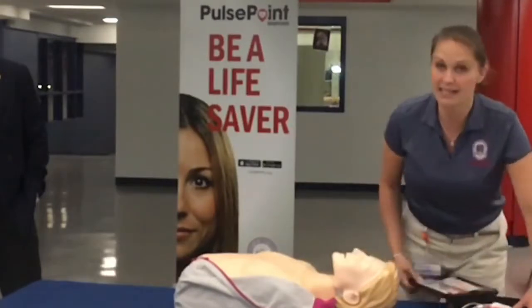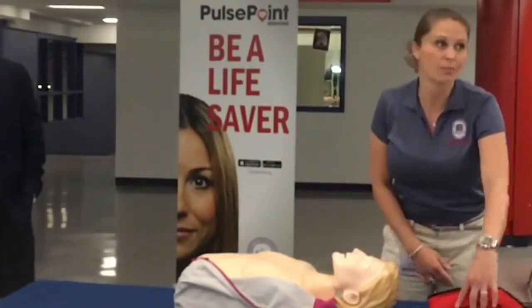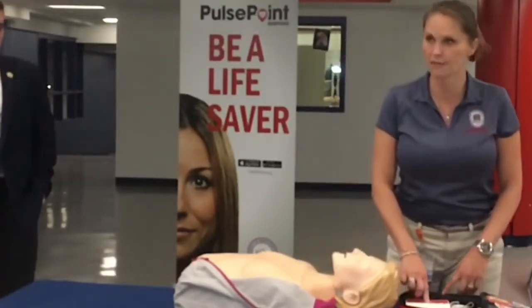This is what the inside of this AED looks like. They're all going to look a little bit different, but usually there are only two buttons: a power button and a shock button, and it will let you know when to push the shock button. So the first thing we're going to do is turn it on.